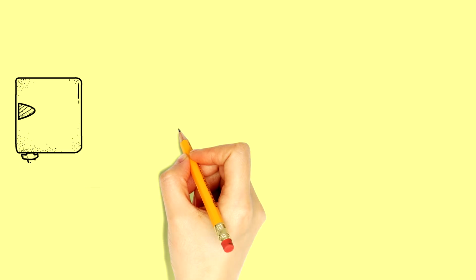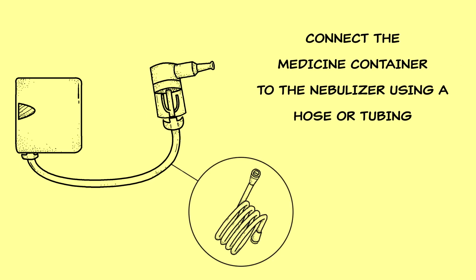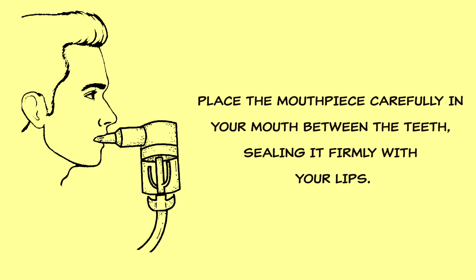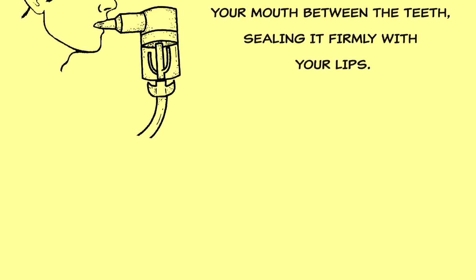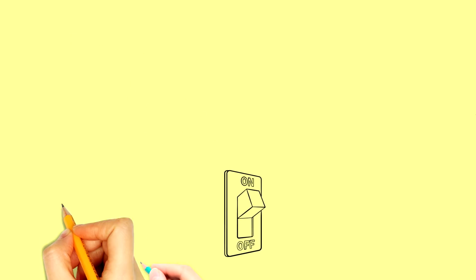Connect the medicine container to the nebulizer using a hose or tubing. Place your mouthpiece carefully in your mouth between the teeth, sealing it firmly with your lips. Then turn on the nebulizer and begin breathing slowly.